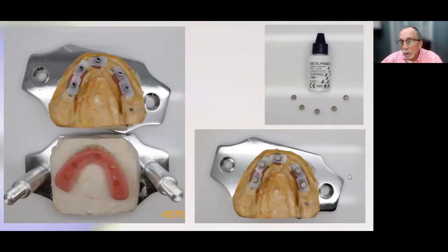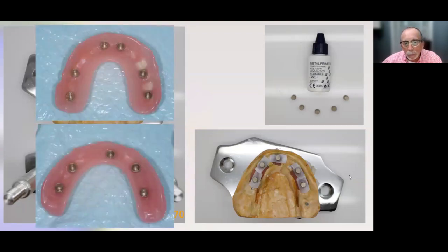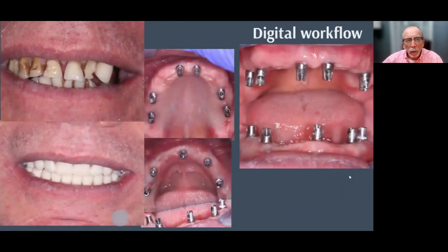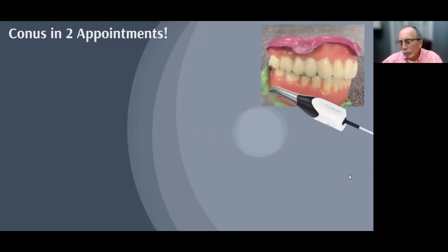And this is the case where we milled that denture out. And this dentist wanted us to pick up the housings in the lab, so we just set up on a reline jig, cut the little gasket sleeves down a little bit, used some metal primer and adhesive to help them stick better, and there they are. They're picked up, and we went to delivery. And so, there he was before, final try-in, and then the abutment placement, and he's done.